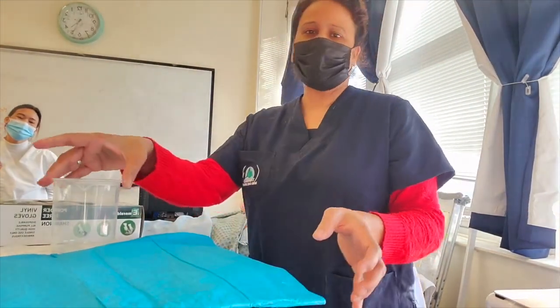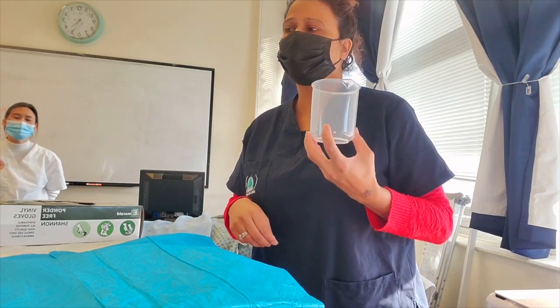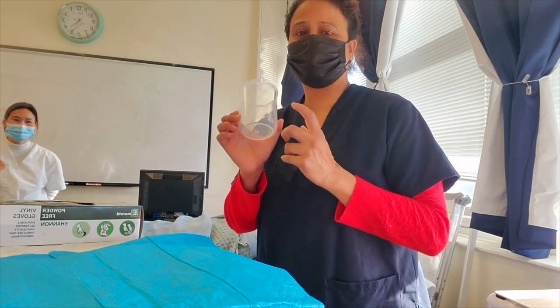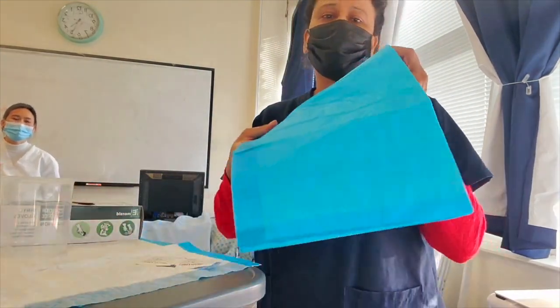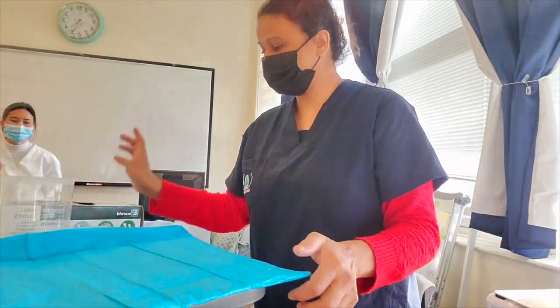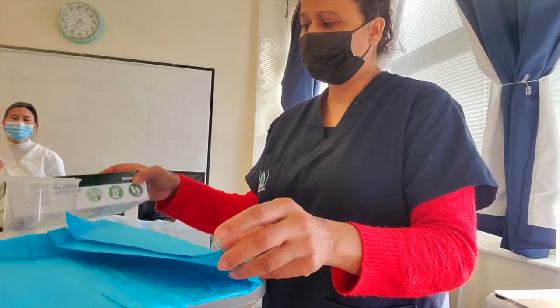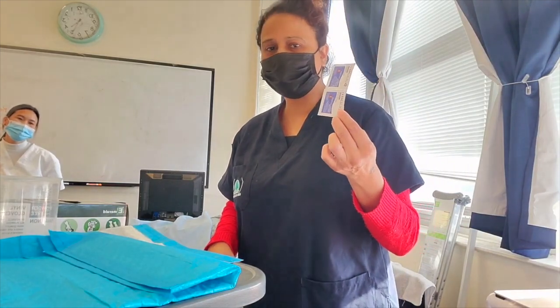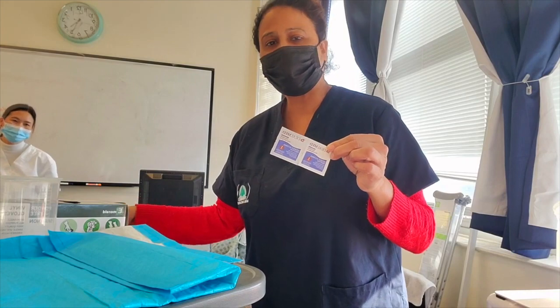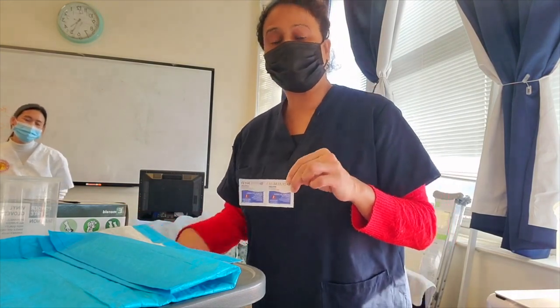I have a graduated cylinder that we're going to use to measure the patient's output from the Foley catheter. I have a chuck that I'm going to place on the floor as a barrier, and I have my gloves.